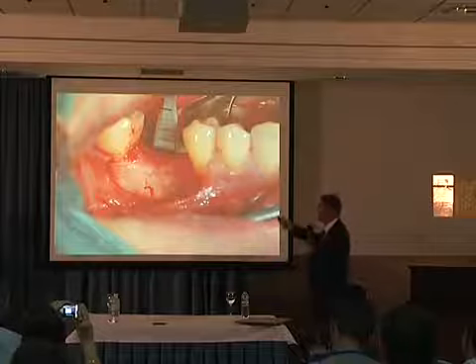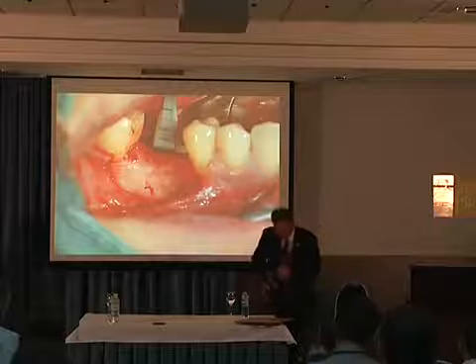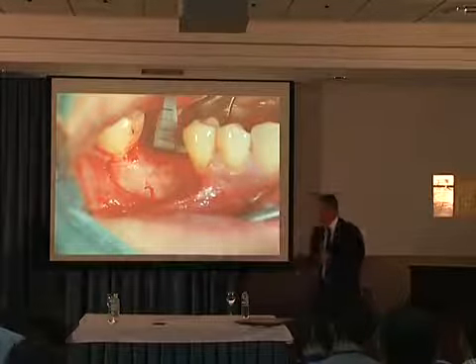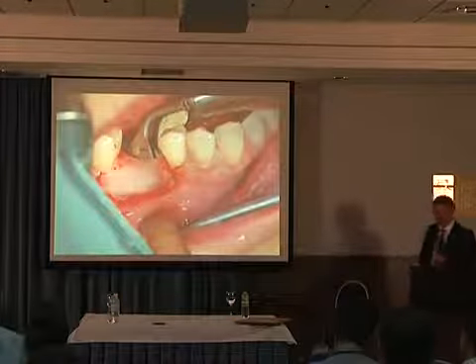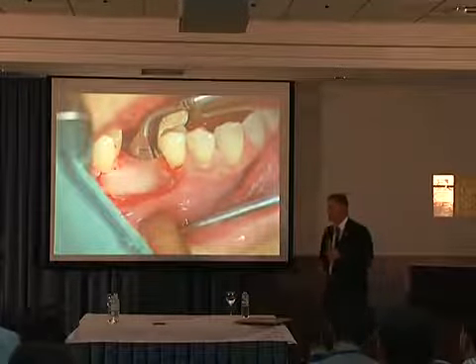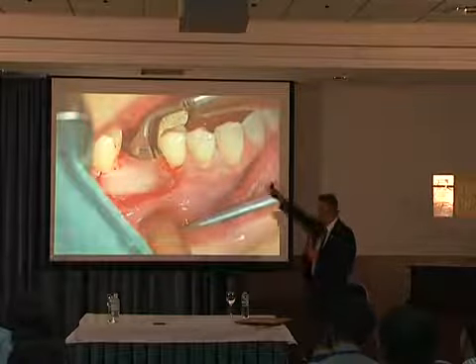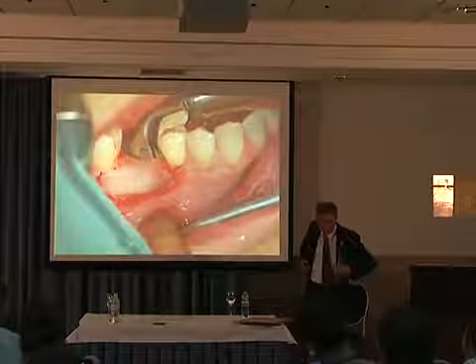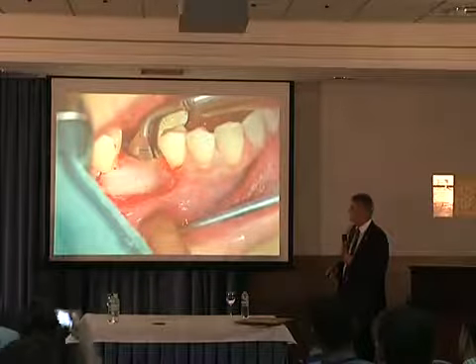So now we start with the piezo surgery. These are quite interesting tips. Like a chisel, they split and condense the bone. Yes, without taking. И они используют специальные насадки пьезохирургические, которые как долото. Он расщепляет альвеолярный отросток, в это же время, погружаясь вглубь альвеолярного отростка, он его расщепляет одновременно. The more vertically you go inside, the more deep, the easier to split. Чем глубже вы уйдете в альвеолярный отросток, тем легче расщепление альвеолярного отростка.